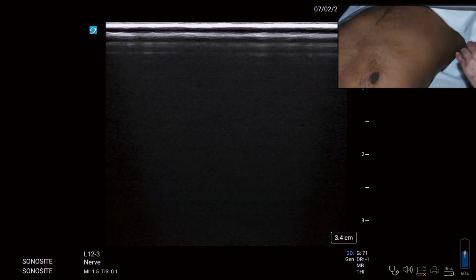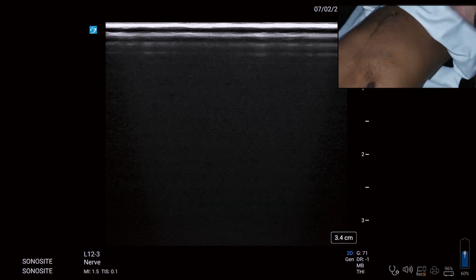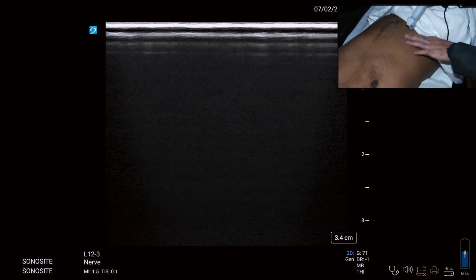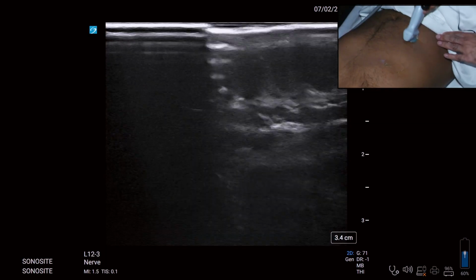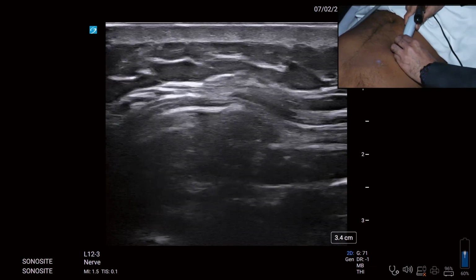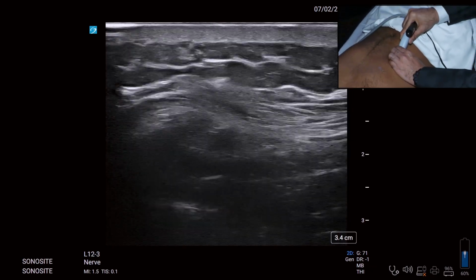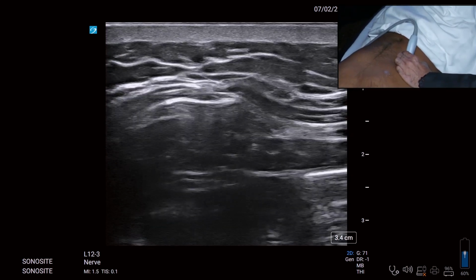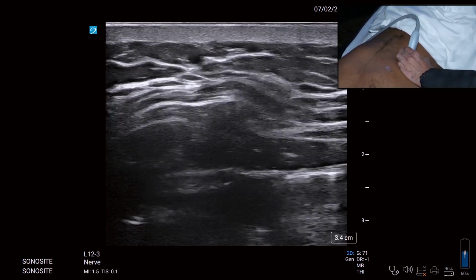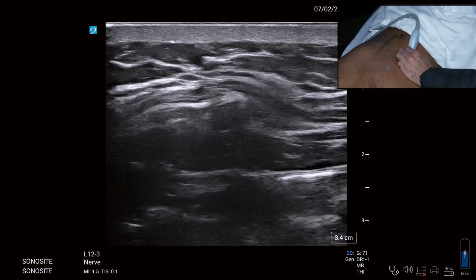Now coming on to the M-TAPA, so in the mid-clavicular line, I feel for the costal margin, and there has to be a steep angulation of the probe. Okay, left hand of the screen, my dear friends, is cranial. Okay, so what I see is the costal cartilage. What I see underneath is the internal oblique and the transversus and the external going.